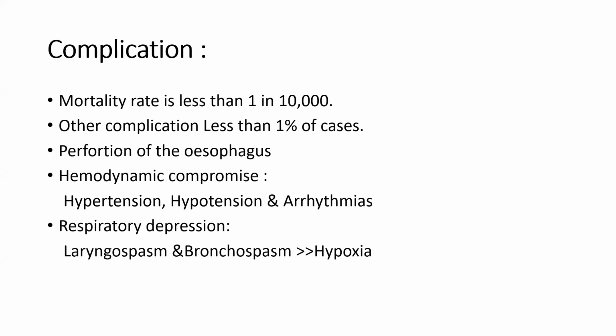For example, if you have some hemodynamic compromise when you start to give sedation with midazolam and fentanyl, the patients start to be a little bit hypotensive. So you guard against that by giving a bolus of fluid. Of course, when you do the baseline transthoracic echo for the patient, the ejection fraction is very important.